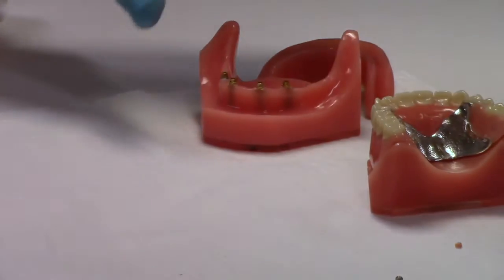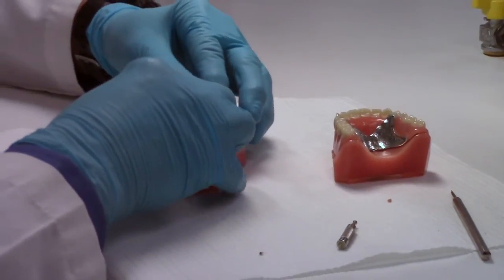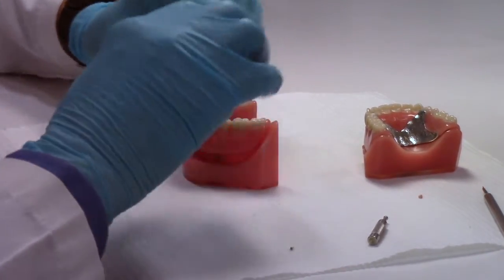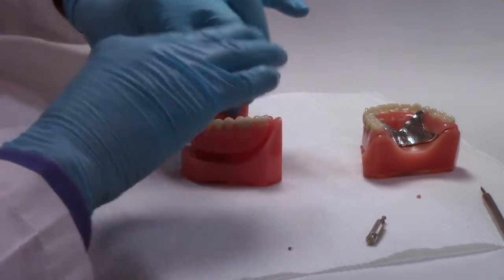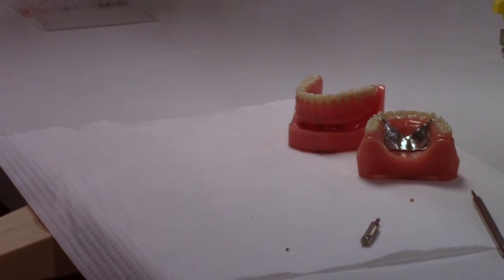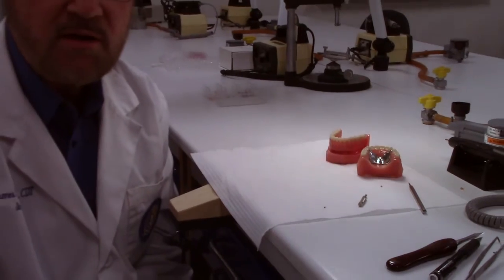And on the overdenture, all replaced. So that's it. That's the procedure on how to change an ERA male.